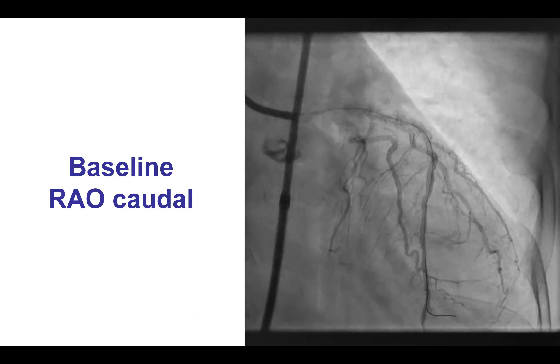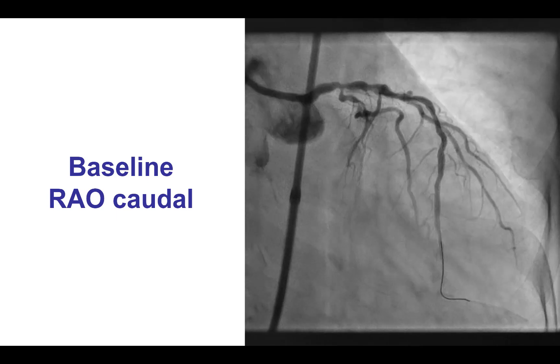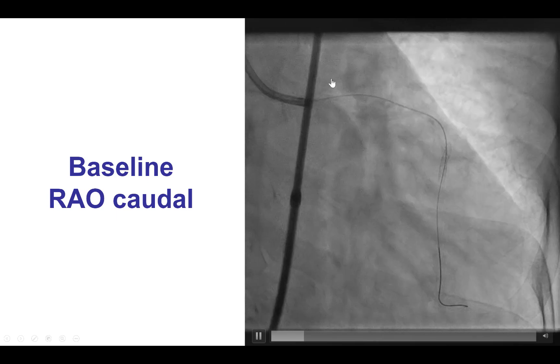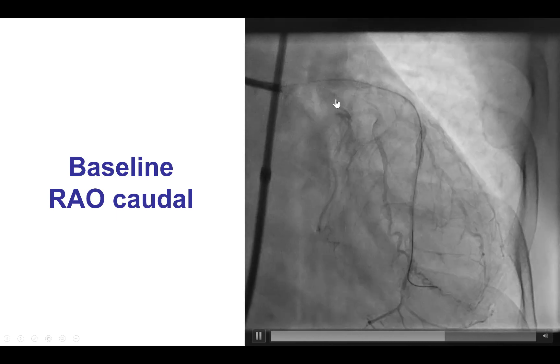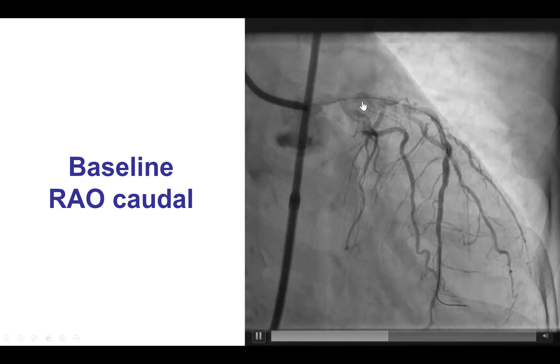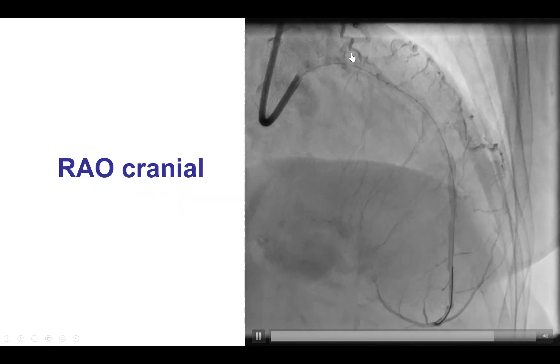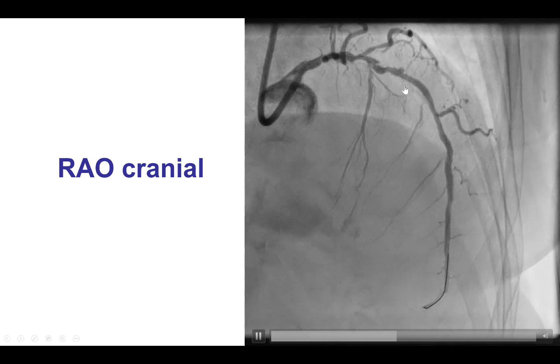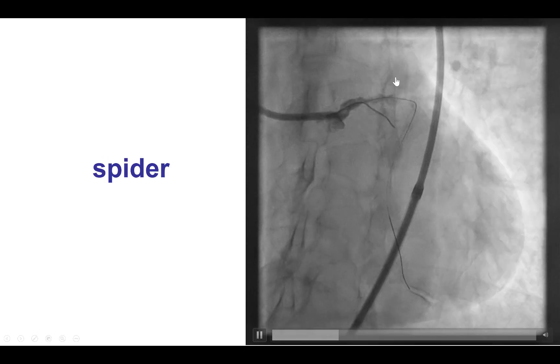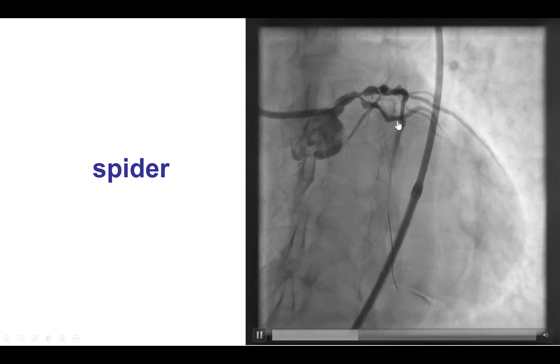The patient had distal left main as well as disease in the circumflex and the LAD, and was turned down for coronary bypass and referred for percutaneous coronary intervention. These are different views demonstrating there is also some disease into the proximal LAD with calcification. There is also significant tortuosity into the circumflex.